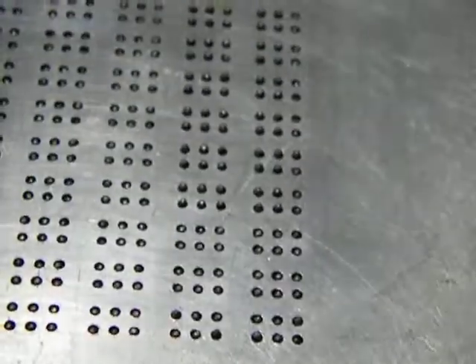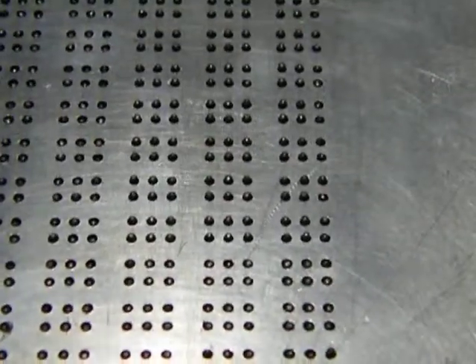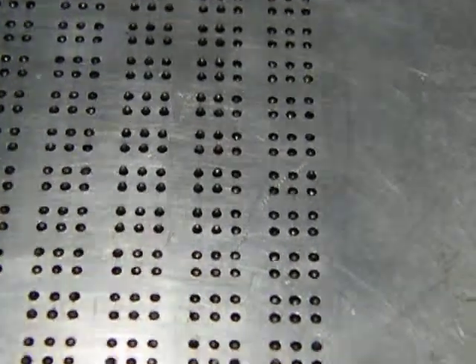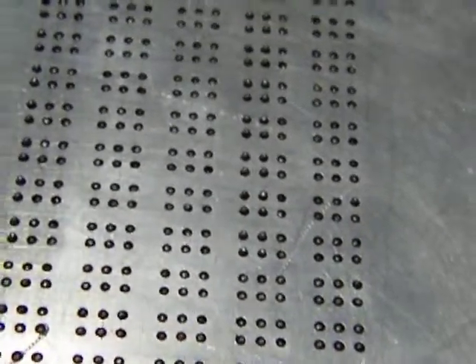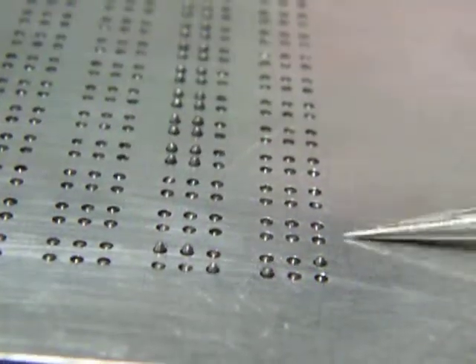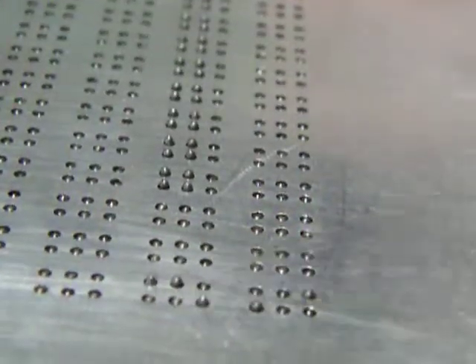Nothing happens to the, so watch, all the actuators, no effect on the first cells. If you look at them, they retain the information that they were set in. These two, the first cell here and here, these two.